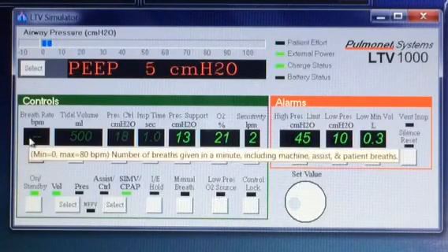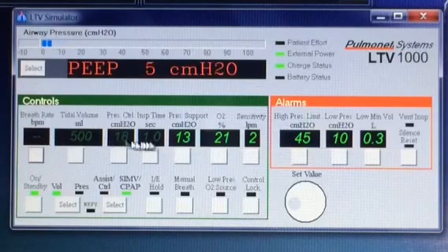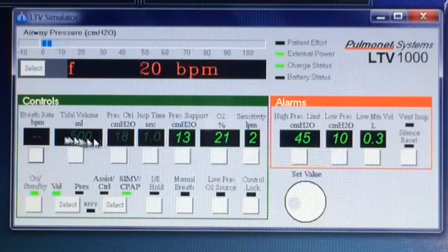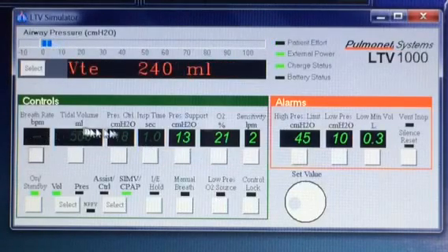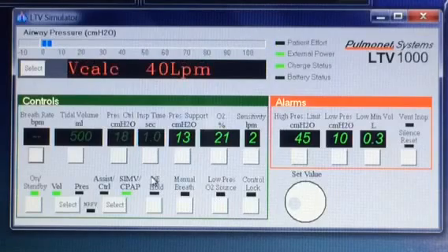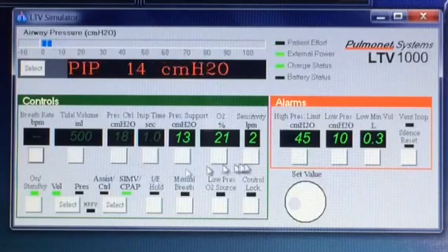If you'll notice, these first four boxes are dim — that means they're inactive. It doesn't matter what is dialed into those, and we're not going to chart them. There are only three settings that determine how they get a breath in CPAP mode.